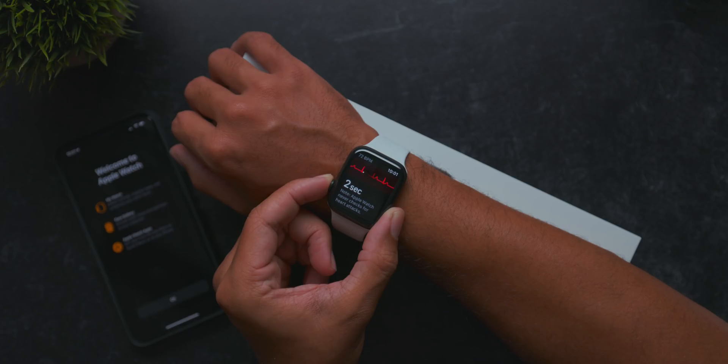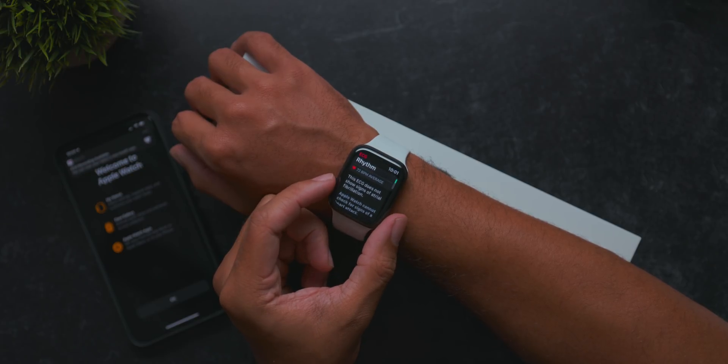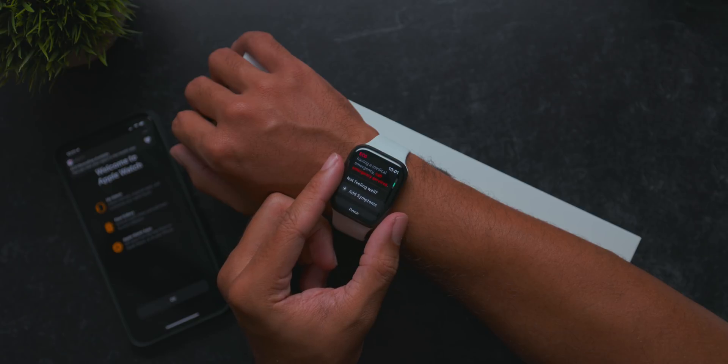My goal today is to test this new blood oxygen level feature on the Apple Watch Series 6 and compare it to the pulse oximeter that I personally used when I came down with COVID. Apple never claimed that their technology is medical grade like this pulse oximeter. But after seeing so many accurate results with the ECG feature, I really wanted to see if this new feature from Apple was just as reliable.